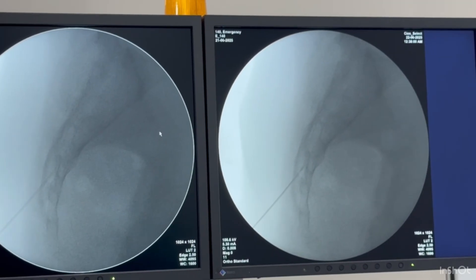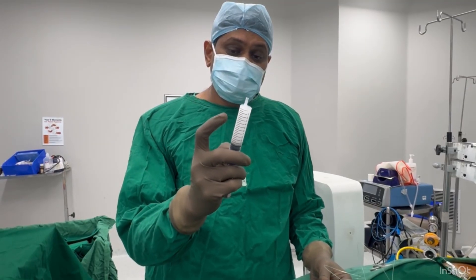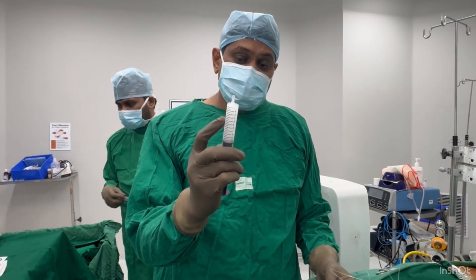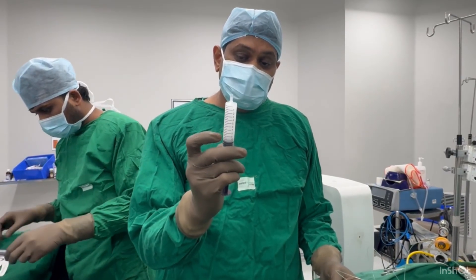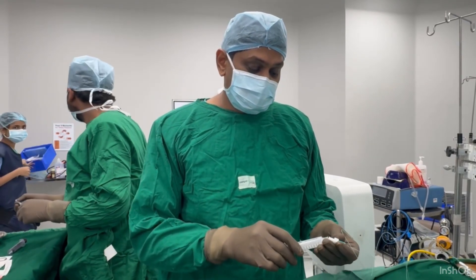The solution consists of 0.5% bupivacaine, 2 cc plus 7 cc normal saline, and 1 cc Kenacort. This is how we are going to inject.